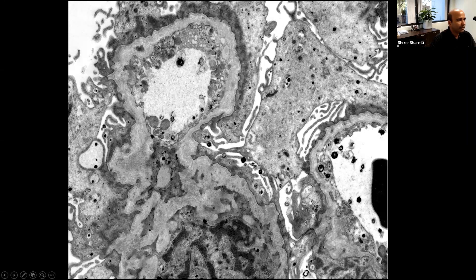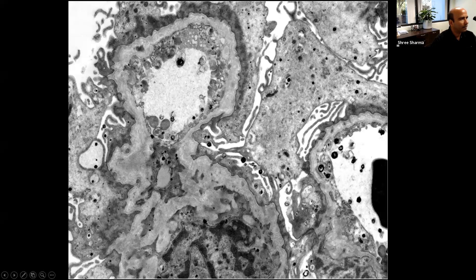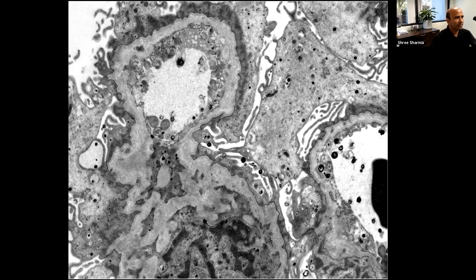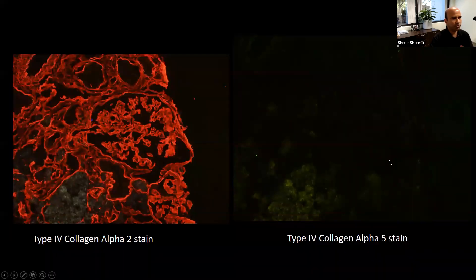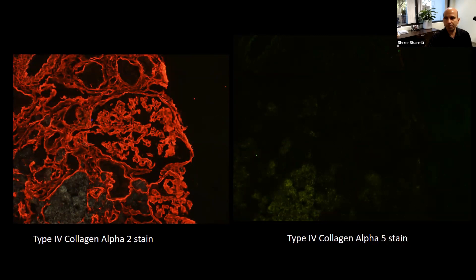A specific stain for Alport: type IV collagen immunofluorescence. The alpha-2 chain stain shows normal expression — a red fluorophore present within the GBM, Bowman's capsule, and tubular basement membranes. When the alpha-5 chain stain is performed on the same glomerulus, it is completely negative. This confirms the diagnosis of Alport syndrome. This stain is very specific but not very sensitive.